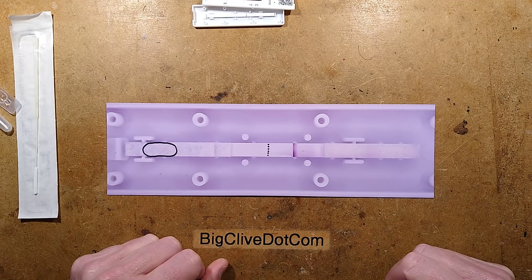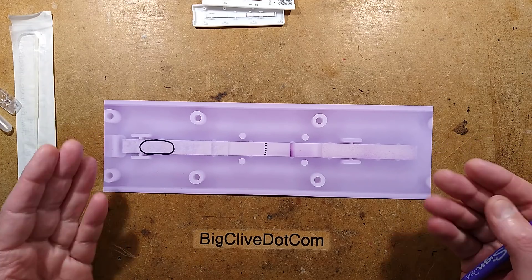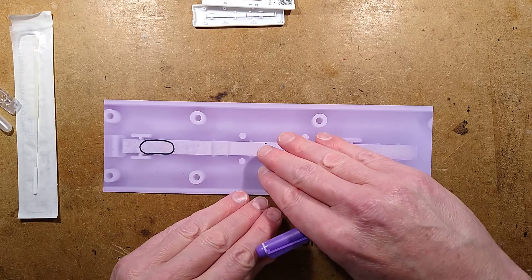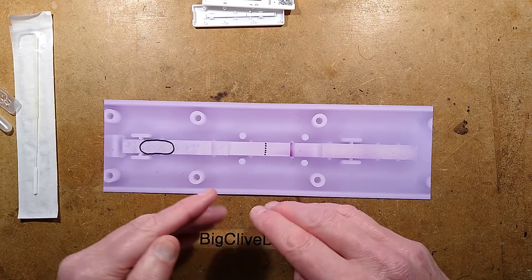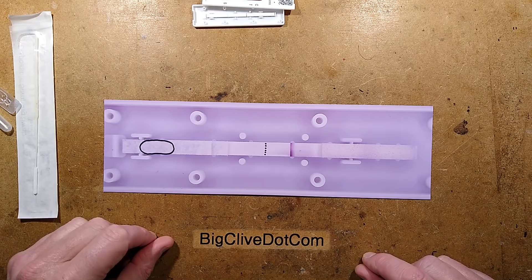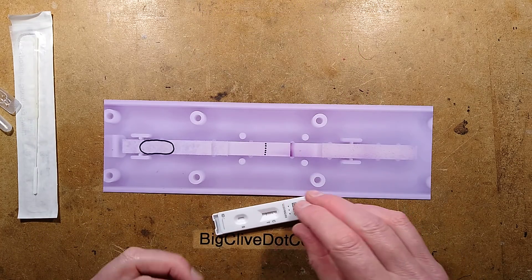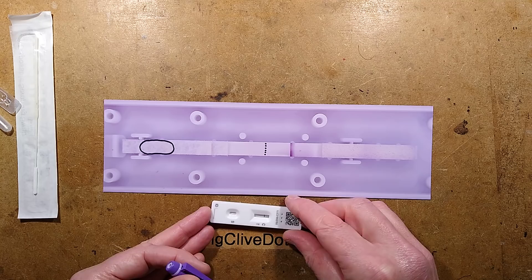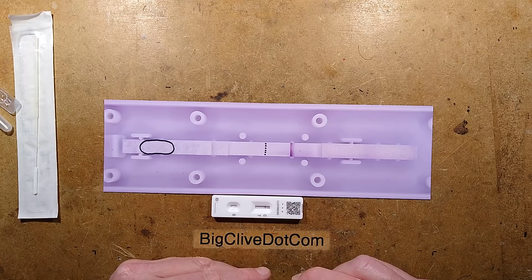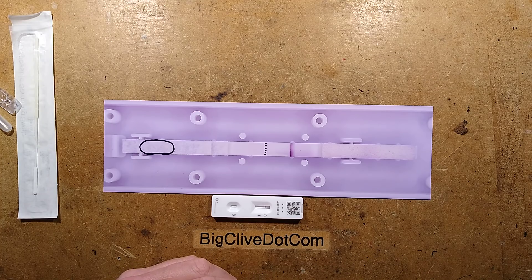It's very clever, very neat. And you think, it's so simple. But in reality, that simplicity underlies the fact that the scientists have engineered these molecules to lock onto a particular key signature of the virus. It makes it very clever. So if you're wondering how these little tests work, that is how they work. It just seems so simple, just that liquid flowing along blotting paper. But the science behind it is incredibly sophisticated and very impressive.